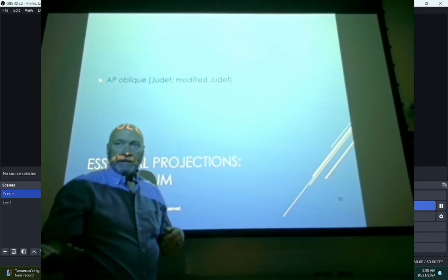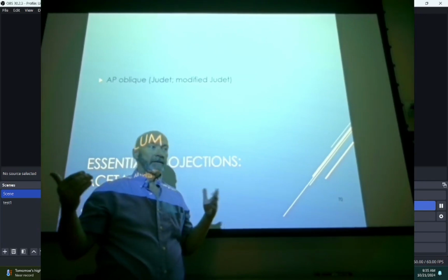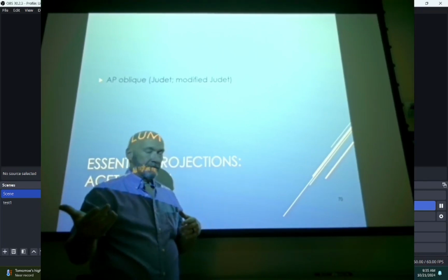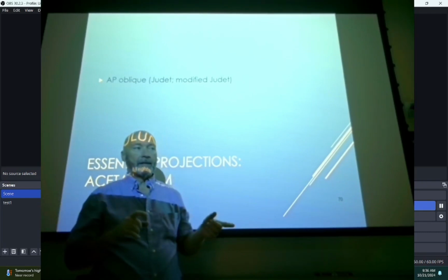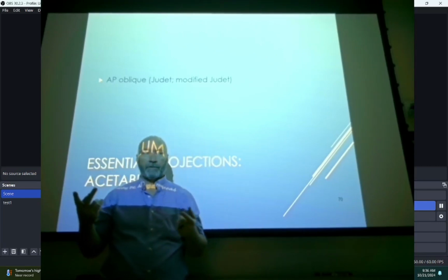So, what do we need to see to diagnose fractures? We can see a fracture line, but we can't see anterior to posterior displacement. So we shoot a second view that is 90 degrees from the first, right? So even though the textbook says the Judet view is for the acetabulum, can we see AP and lateral of anterior pelvic bone fractures? The answer is yeah. In two views, we can see both of those.